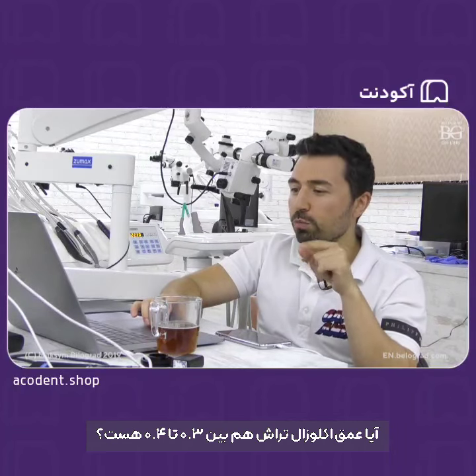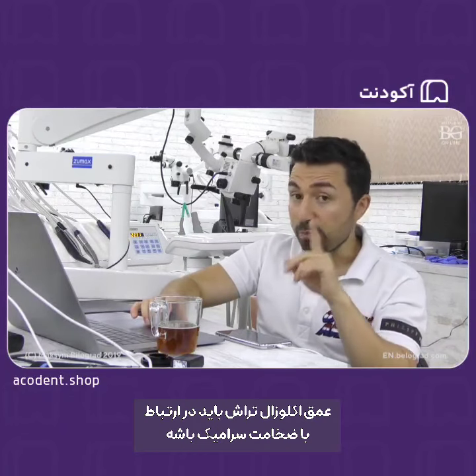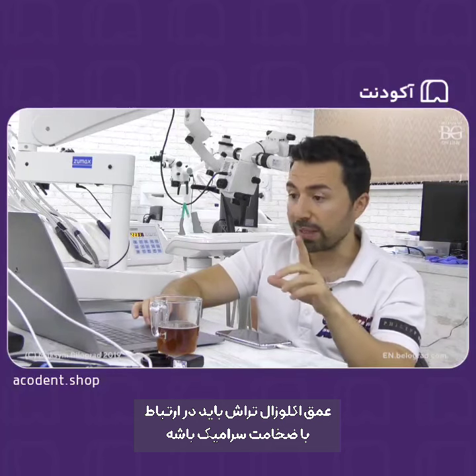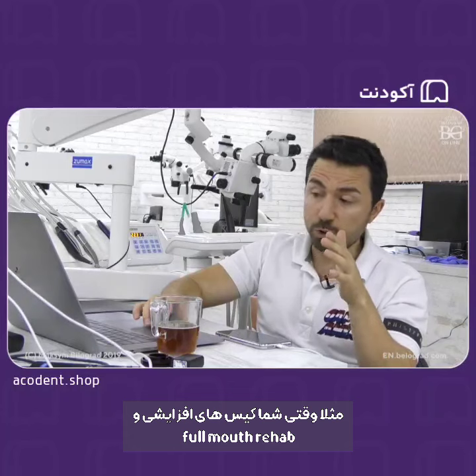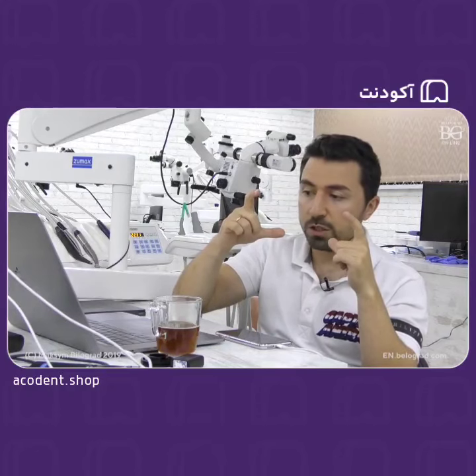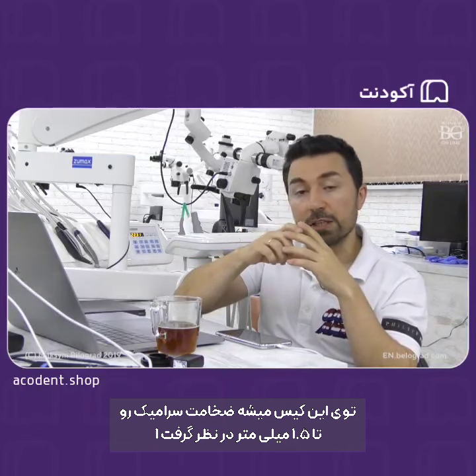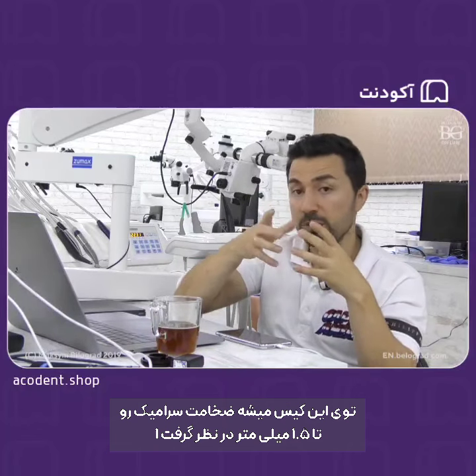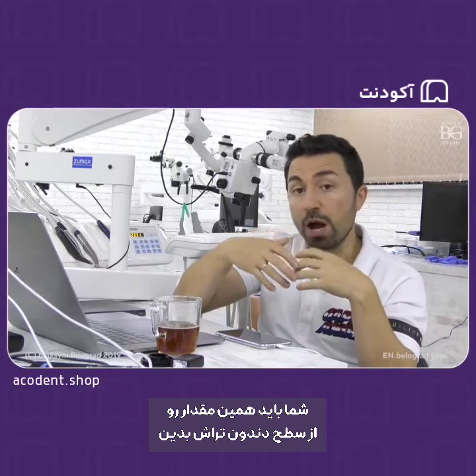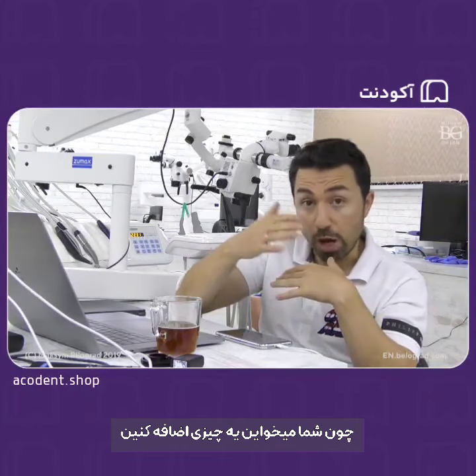Another question. Your occlusal prep depth is also 0.3 to 0.4. Occlusal depth of preparation has to correspond to the thickness of ceramic. Let's say, if you do an additive case, when you do a full mouth rehab, for example, and you need to raise vertical dimension, so you need to add something. The total thickness of ceramic may be 1 millimeter or sometimes even 1.5 millimeters. But that does not mean that you have to prep the same amount from the tooth surface, because you actually add.